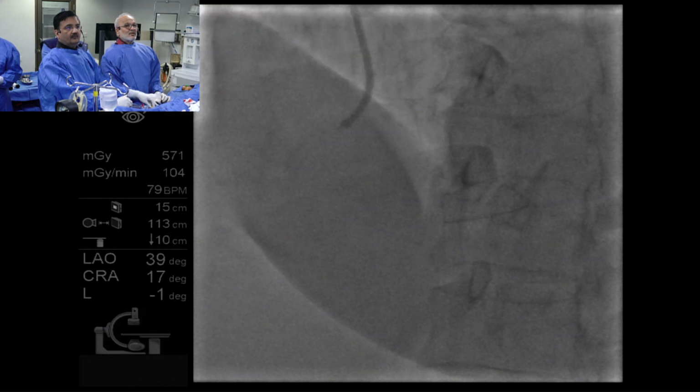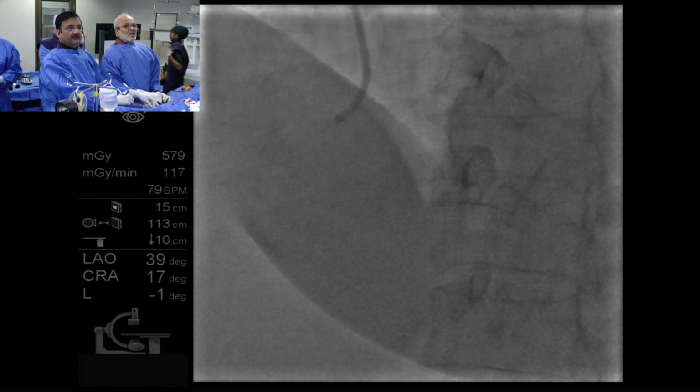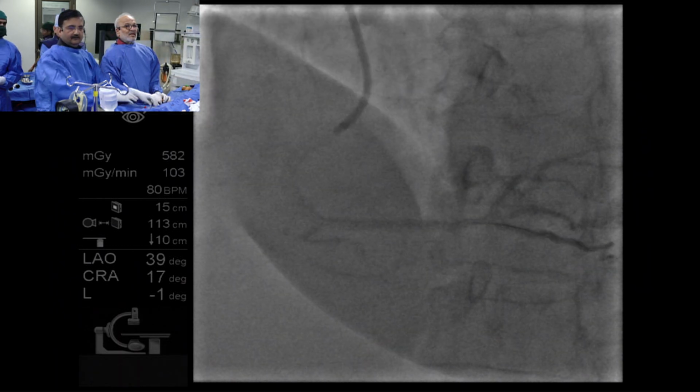You mean the button, the new rotor? I think, Sanjay, we need to give... yes, it went in. Yeah, I am lucky. Very fine, lucky.